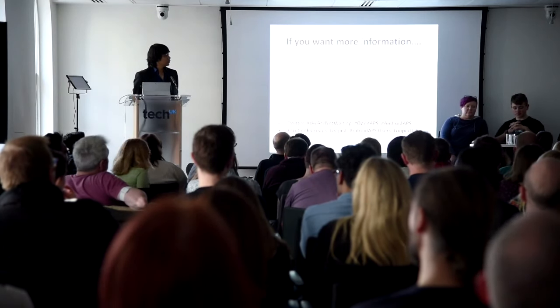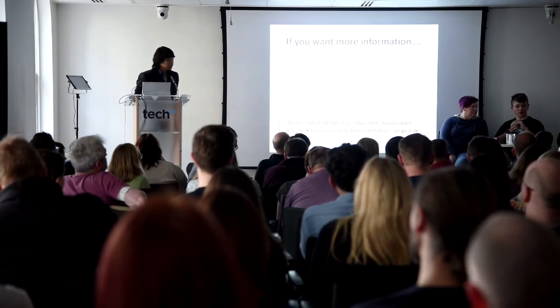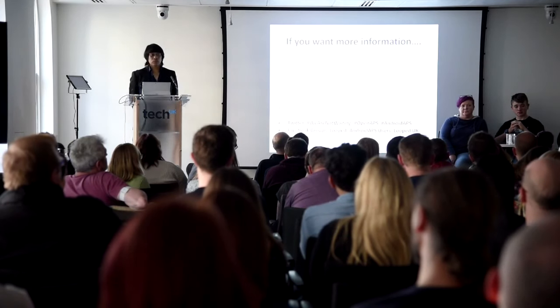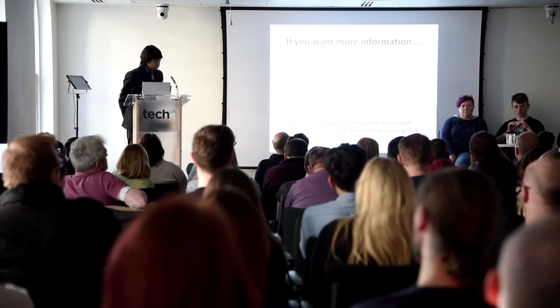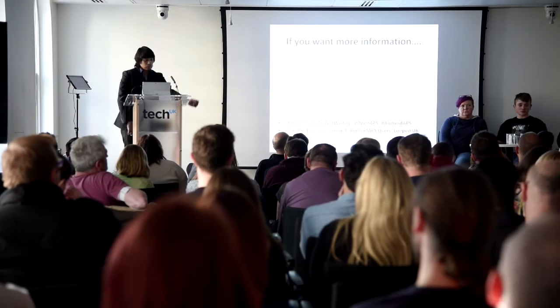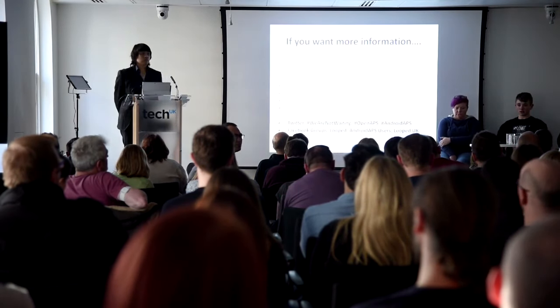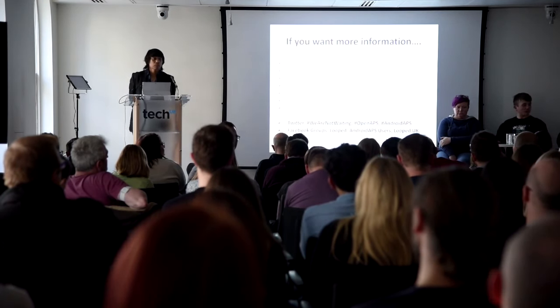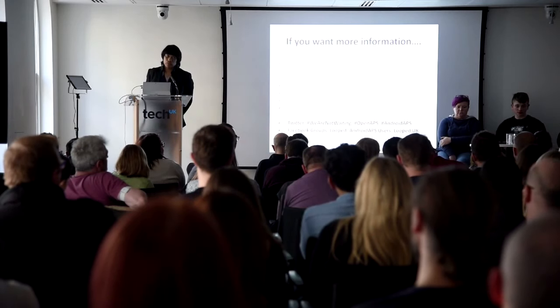So the systems work in slightly different ways, but both Loop and Android APS include bolus calculators that take into account insulin on board from various temporary basal rates or already given insulin. AutoTune also includes a calculation around carb ratios, as long as the data you've given into it is good around your carbs and that it's getting good data from your pump and your CGM.